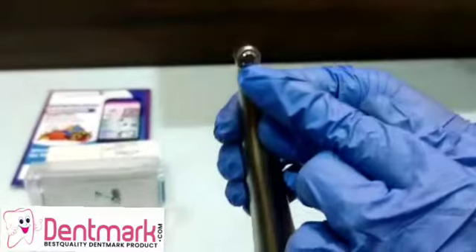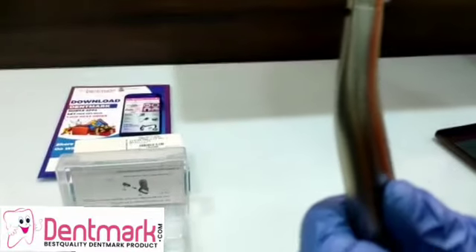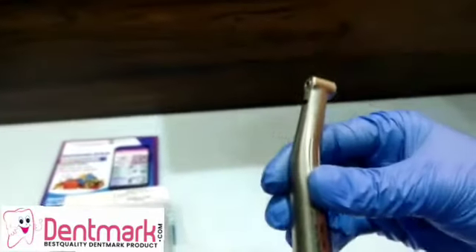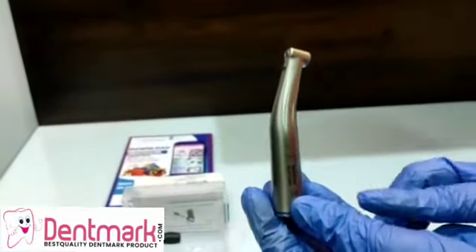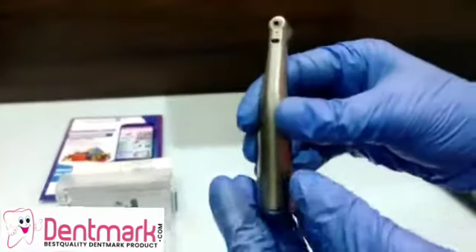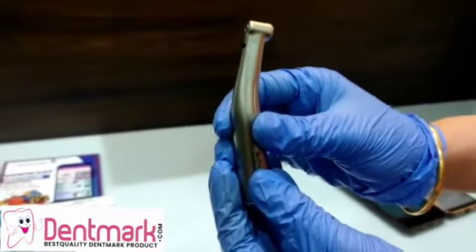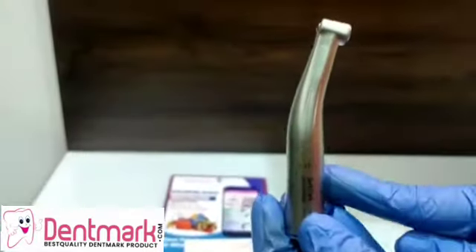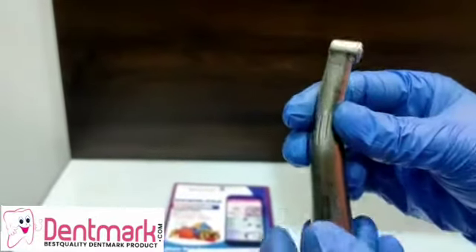It is a push button handpiece — you can see this is the push button head. Apart from this, it is a fiber optic handpiece and it is contra angle as well. You can see the angle is contra angle, and it comes with a single spray. It is used for carbide bars. This is a premium quality handpiece and it comes with a smaller head.